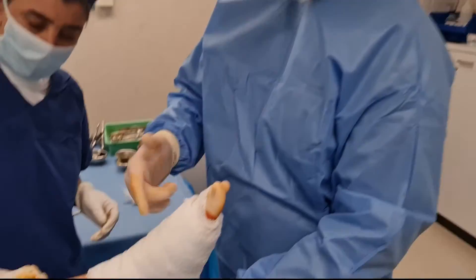So we've got it under the bandage. We're going to put some Coban around it, and then we're going to review this gentleman in a week to see how long he's had pain relief.